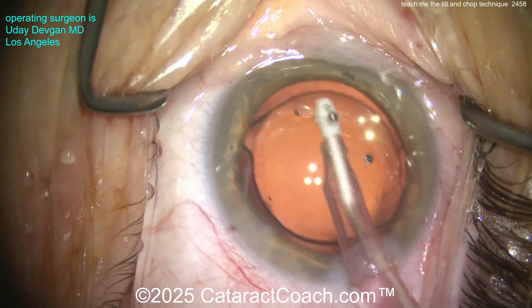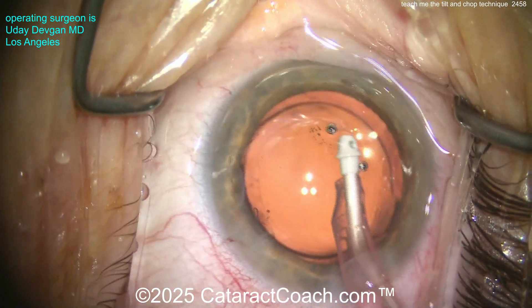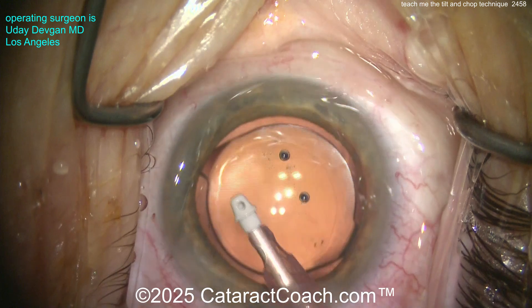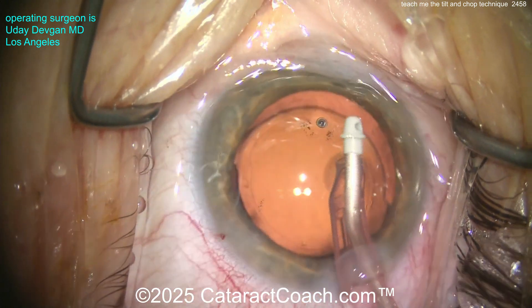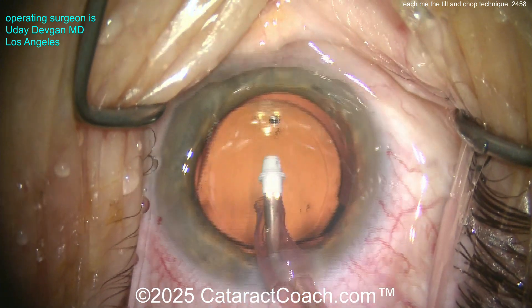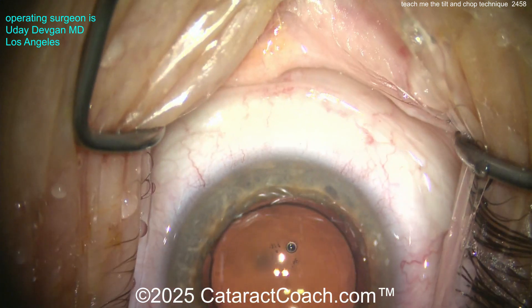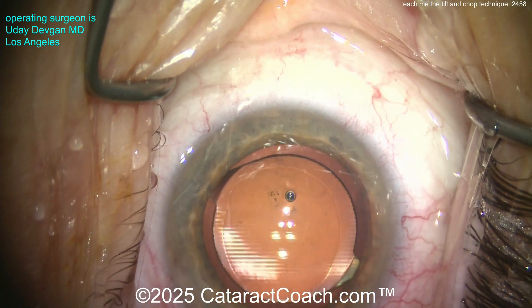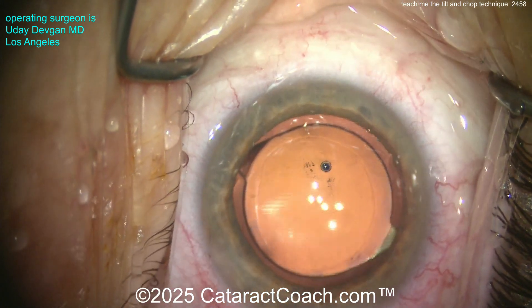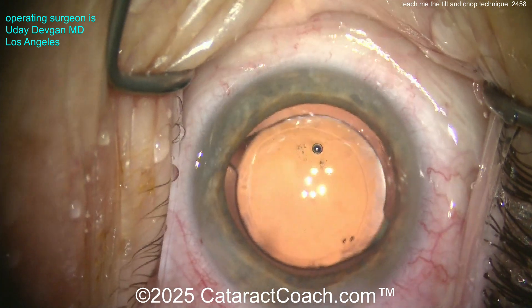Getting that viscoclastic washed out and cleaning up pretty nicely. Looking at the tip of the phaco sleeve — not quite adjusted the way I like it; I'll have my scrub tech help me next time. But look at that, all cleaned up very nicely. The rhexis size is just about five and a quarter millimeters — between five and a quarter and five and a half. Overlap on the optic 360 degrees looks great.